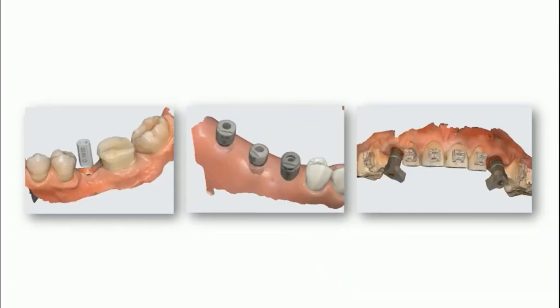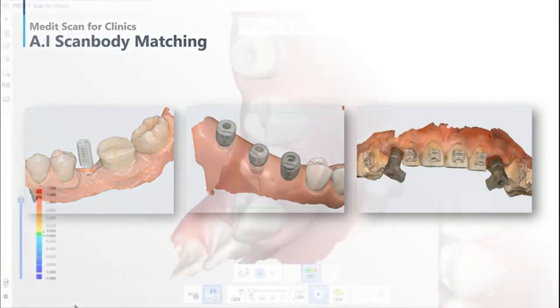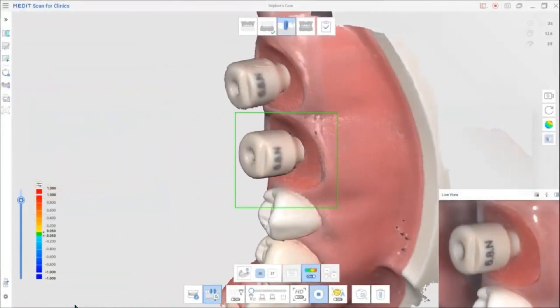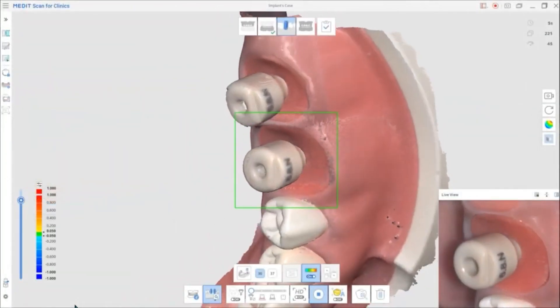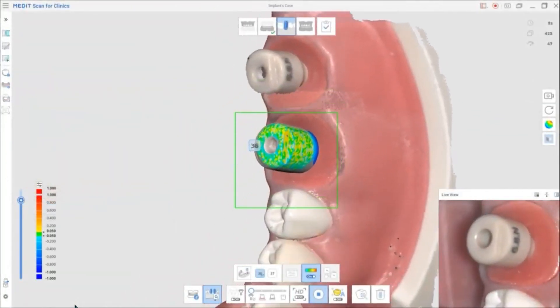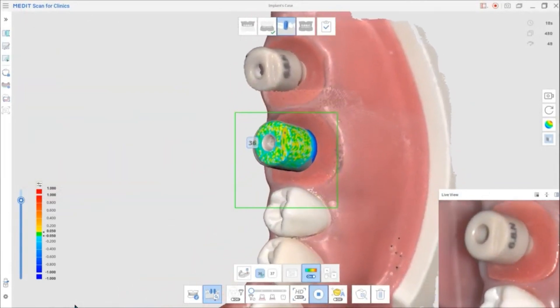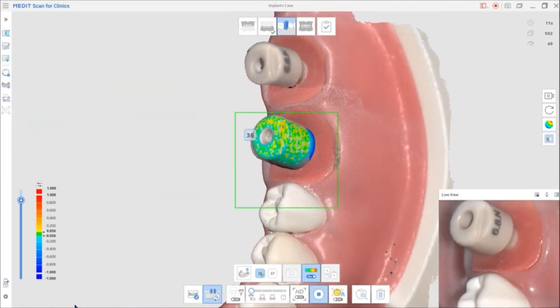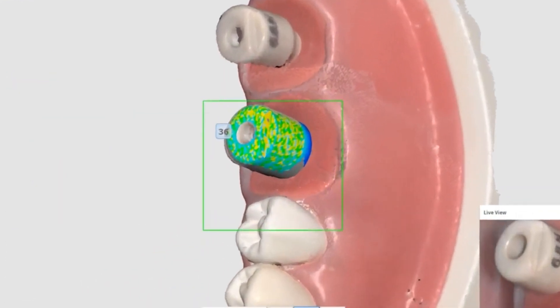AI Scan Body Matching is useful if you are scanning areas difficult to reach, such as a narrow implant area or metal scan body materials. You don't have to strain to scan difficult areas since the library will automatically align to the scan data, allowing you to scan comfortably and quickly.